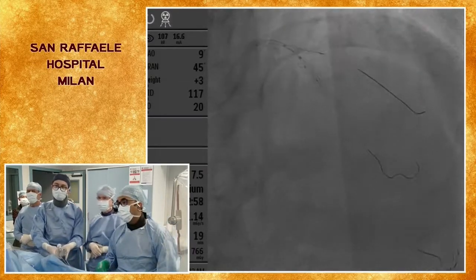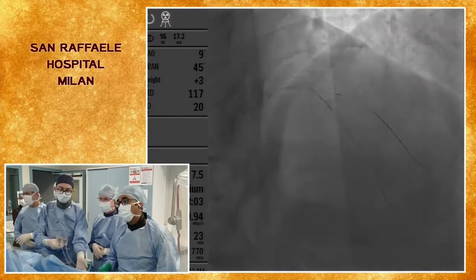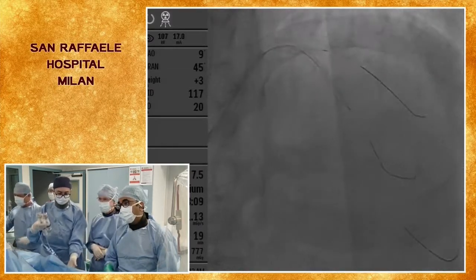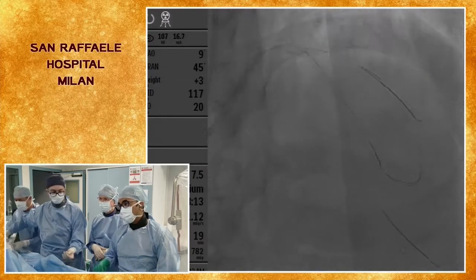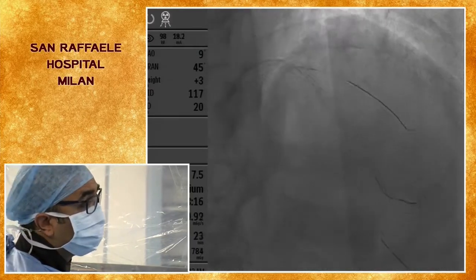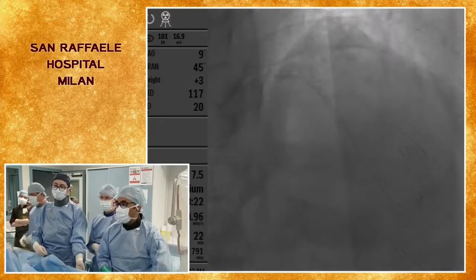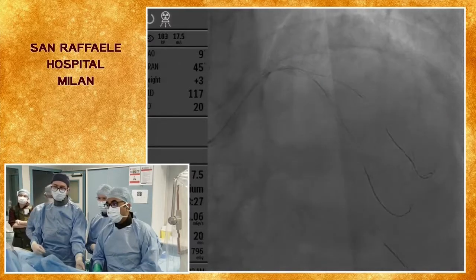And I think here it will be very important to do the IVUS towards the LAD. I think we'll do first the IVUS towards the LAD to see the opening, how big is the area where we did provisional. It's not common to be provisional towards the main branch. Maybe pull back a little bit the wire in the diagonal. Okay, I'll pull it back in a second.